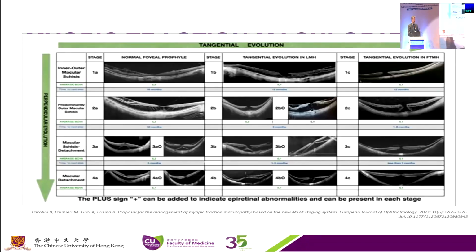I like your ERG result, but if the patient has very severe glaucoma, and we wonder if this patient is for the vitrectomy, ILM peeling, in that case, I think the macular buckle is indicated because it is used without vitrectomy. In that case, we should remove the anterior chamber fluid and lower the pressure, and we can select the location of the buckle. Because with vitrectomy, we can lower the pressure to see where the buckle is, but the macular buckle's merit is that it is used without the vitrectomy, I think.